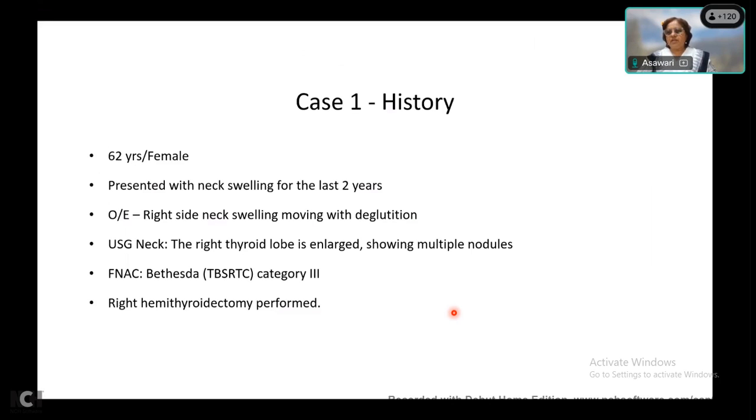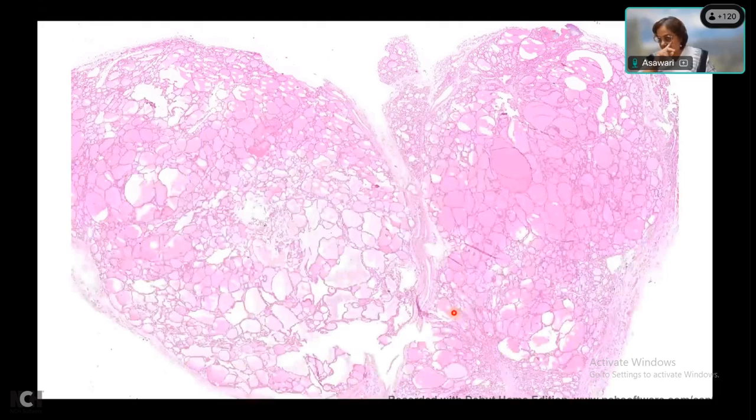So who wants to take this case? Or should I just arbitrarily call someone? Ma'am, I will take this case. Manasi. Yes, ma'am. Okay, go ahead.